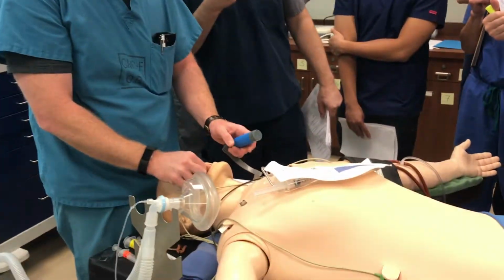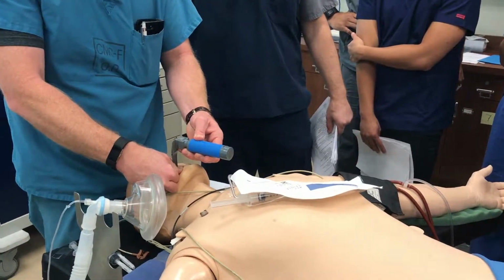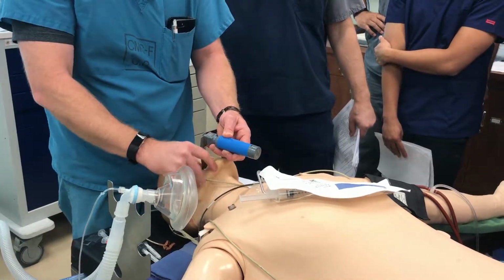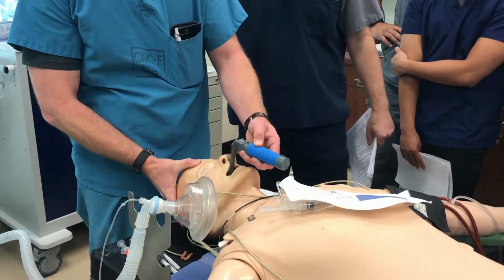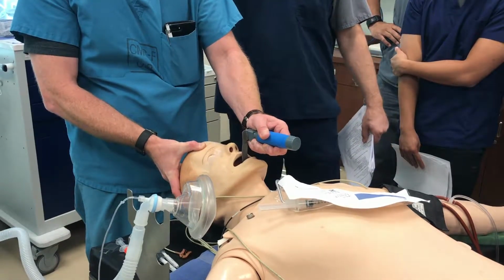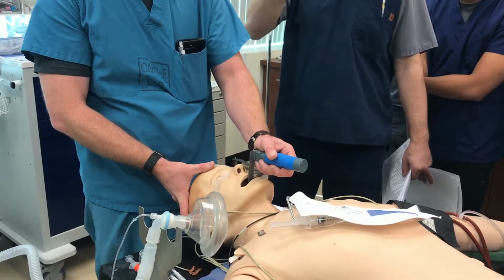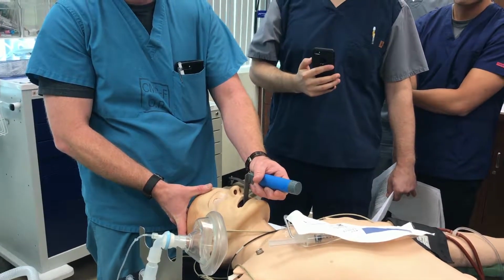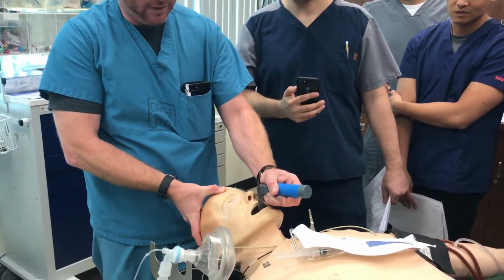Open that mouth up, first of all. That's just to introduce the tip of my blade. Once this blade is in at all, you don't need your hand there anymore. Move this to the right side of the mouth, making sure that I'm not going to pinch a lip in between the teeth or anything. And I'm going to walk down the back of the tongue, pushing out. Caudad pressure. I'm going to see the epiglottis. I got it. We'll talk about how to use a Macintosh blade, where it seats. It seats in the vallecula. You guys learned that in anatomy already, I'm assuming. You will. And I see the vallecula, and I see it in the vallecula. I'm lifting up and out.